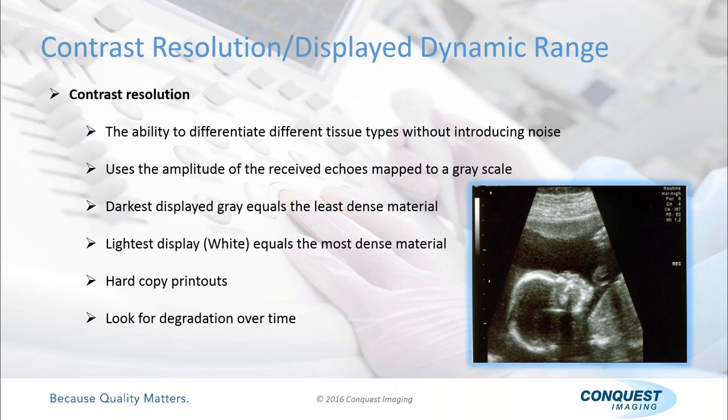You know, it seems like I keep saying that, but it's a principle that it's only going to help you. If you have images of the system when it was in its fully functional state, and you can come in with your phantom to evaluate this image quality problem that the technologist or sonographer is talking to you about, well, then you have hard copy printouts to go back and look at and compare to the ones you're looking at today.